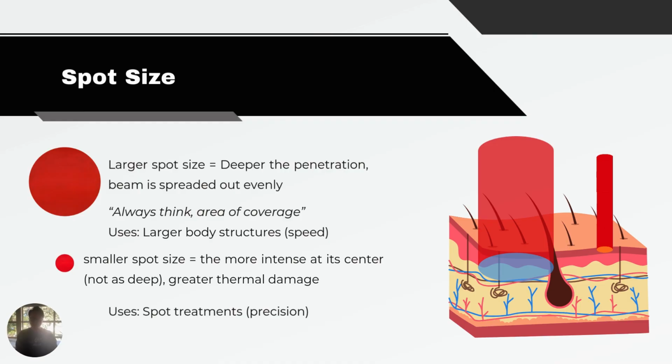Great for precision and also cutting. So when you're treating, the way you use spot size is making sure that you damage only the area that you target and not overexpose it when not needed.